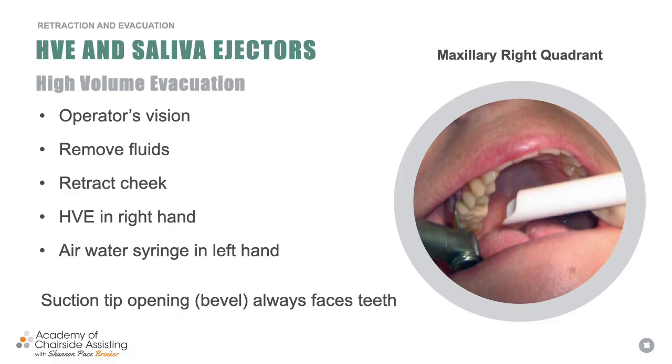I have it just slightly away, a little bit less than an inch away, so I can jump in there really quickly and come out. If the patient has a lot of saliva, I can quickly put it closer in and come right back out. Put it closer in and come back out.